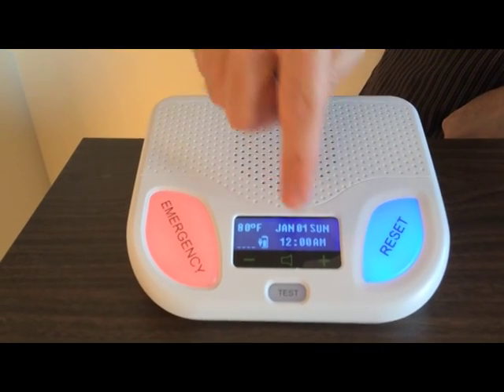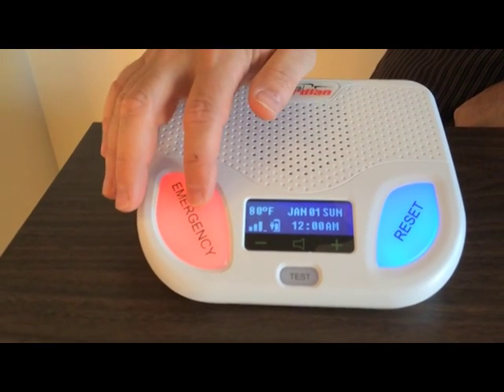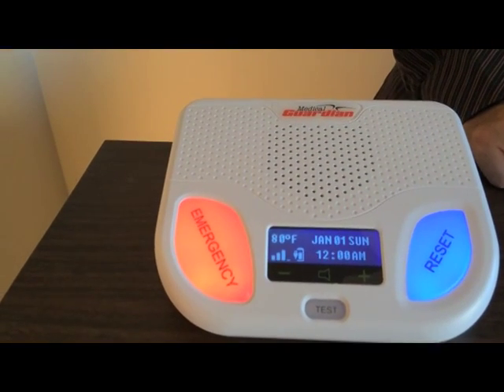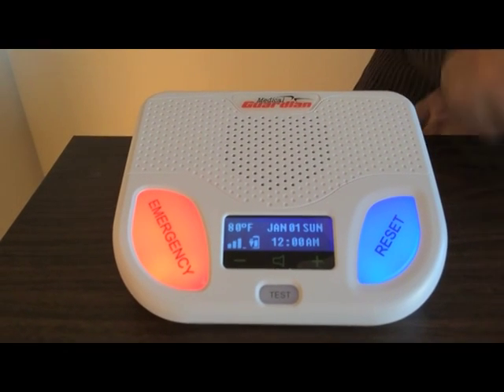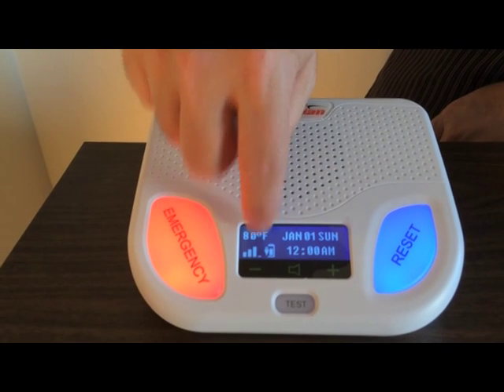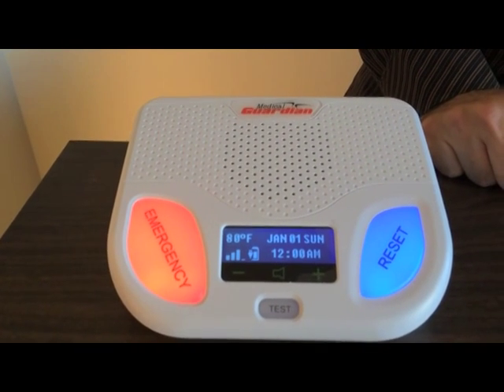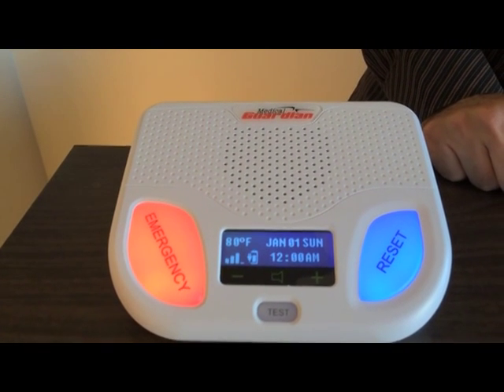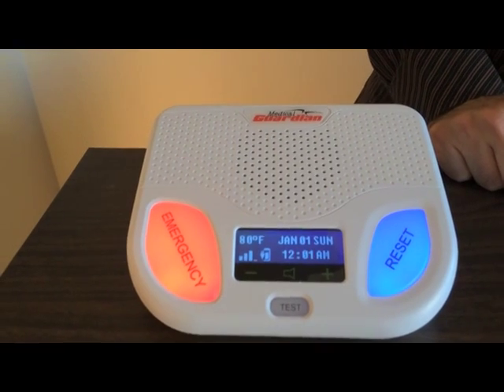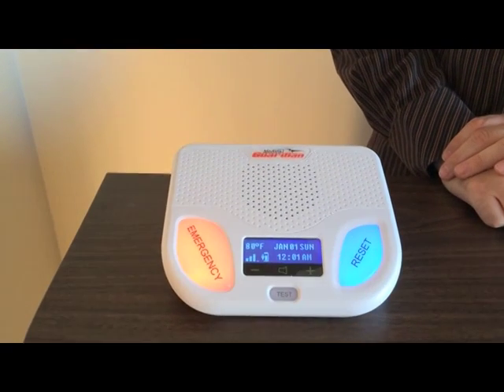So now we're going to do a test. There's a test button, but you can press the emergency button and that will test it also. It's calling over the cell lines — you can see the cell bars right here. Call in progress. Please stand by for operator. Thank you for testing your device. Your test is now complete. Goodbye.